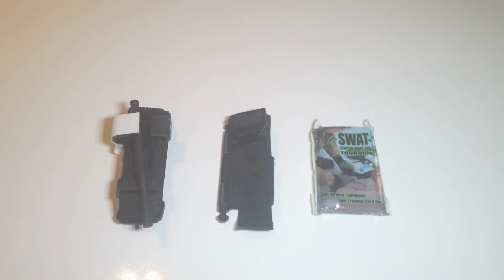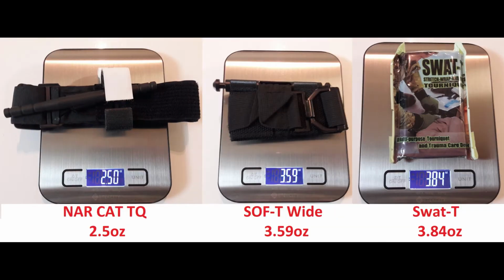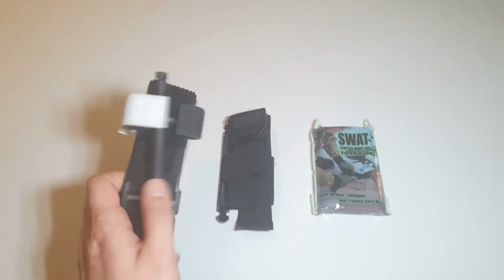So which tourniquet is best? Like many things in life, it depends. It depends on what you want. If weight to performance is most important, I would say go with the CAT. It's the lightest of the 3 and it has the recommendation of the Committee on TCCC, and there's a lot of data that proves it works.